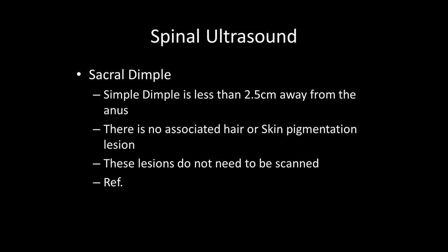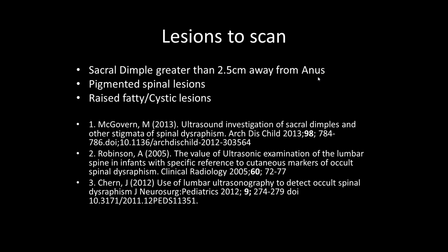So dimples are now broken up into a simple dimple or a dimple that needs to be scanned. A simple dimple is less than 2.5 centimeters away from the anus. There's no associated hair or skin pigmentation. These lesions do not need to be scanned. There's some references on the next slide. A sacral dimple that is greater than 2.5 centimeters away from the anus, has a pigmented spinal lesion, or this raised fatty cystic lesion, yes, those lesions do need to be scanned.